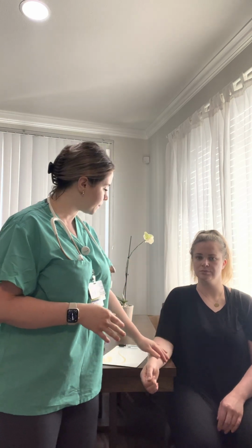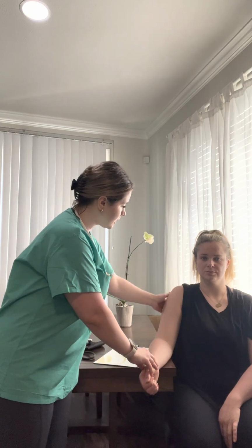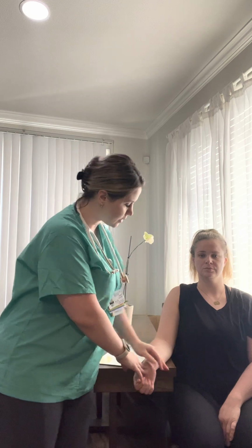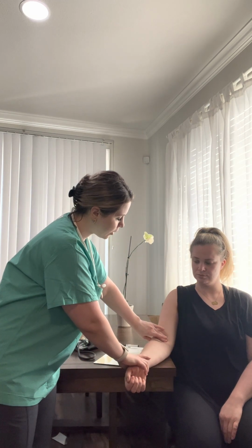Now that we have assessed that, we're going to go ahead and take the patient's blood pressure. Before we begin, we do have to raise our patient's sleeve. We're going to make sure that the patient's sitting up and their feet are placed flat on the ground and not crossed. We're going to relax the arm on the table, and we're going to identify the brachial artery.